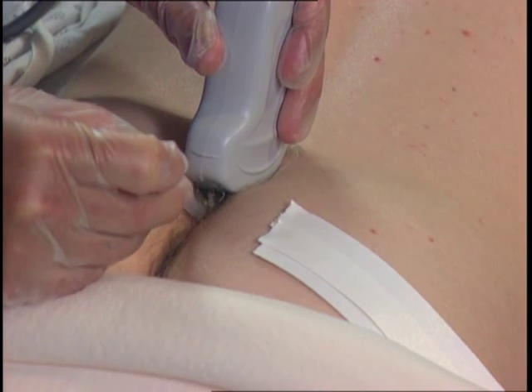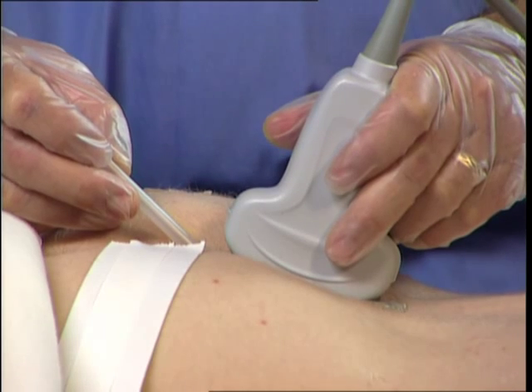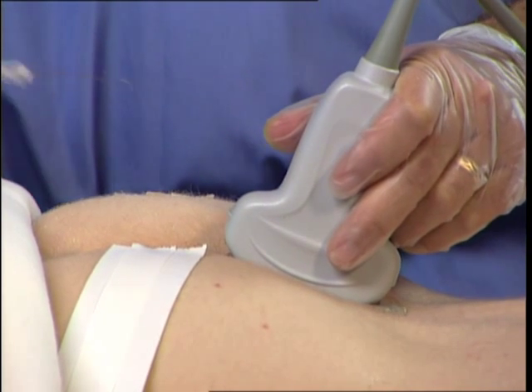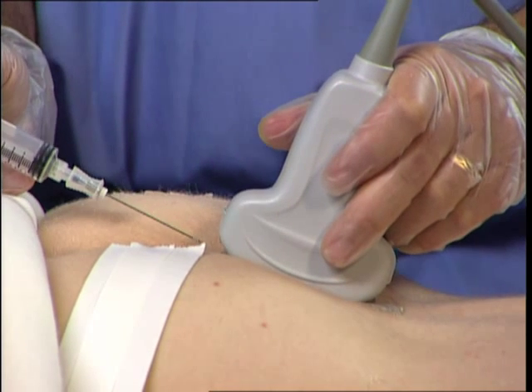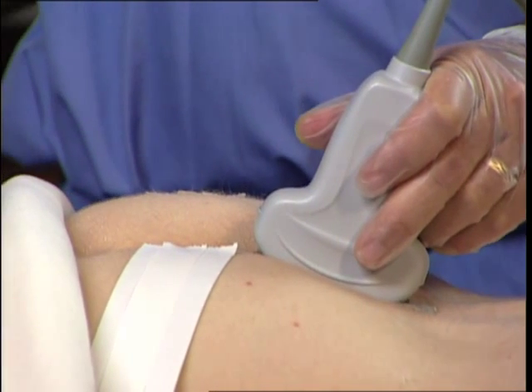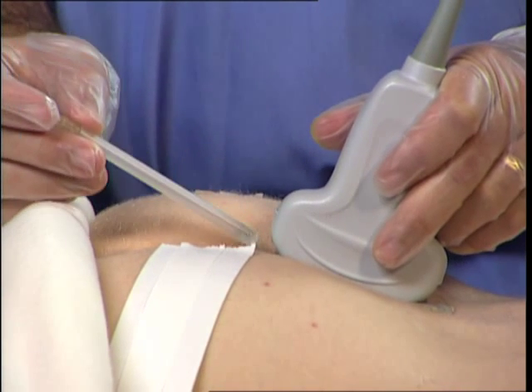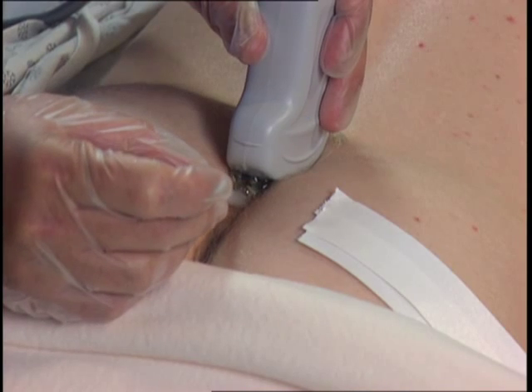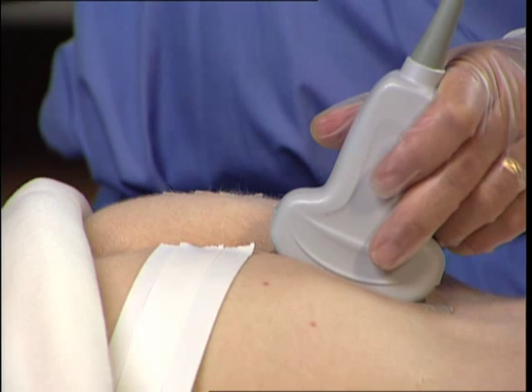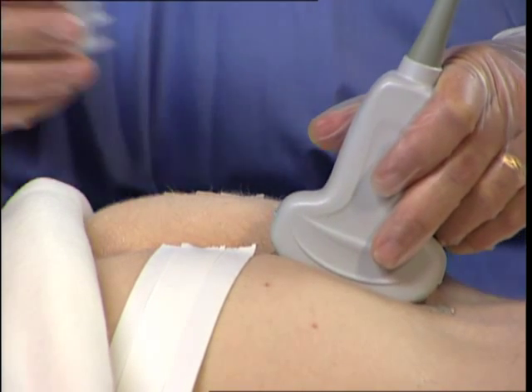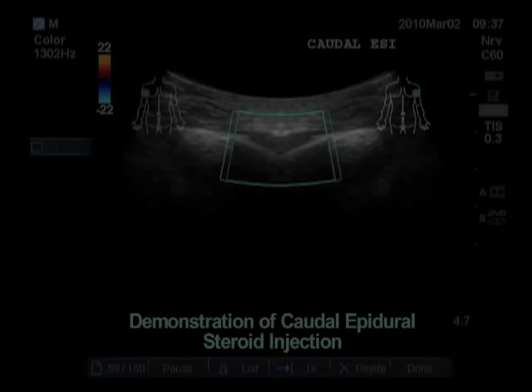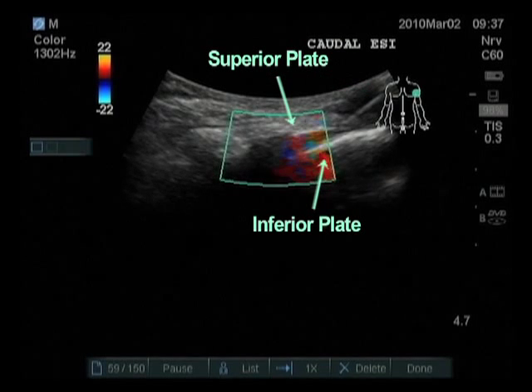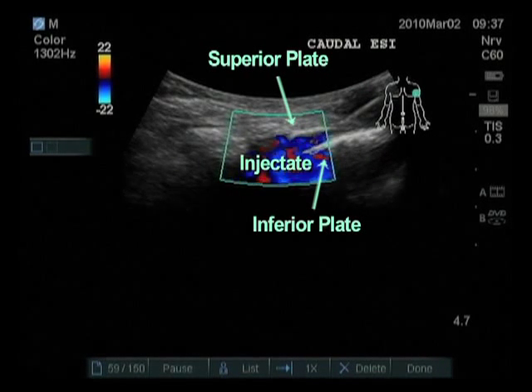I'll demonstrate where that access point is. The needle is angled thusly. At this point, I would utilize the local anesthetic to perform a local anesthetic track down to this level. I would then place the 3.5-inch 25-gauge spinal needle along the same anesthetized track. Once between the two plates, I would attach the local anesthetic and steroid mix. The needle is visible as this view is in the long axis. The sacral plate is clearly visible, diving anterior and cephalad.